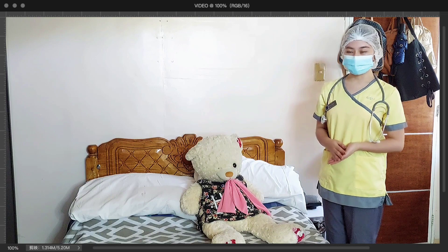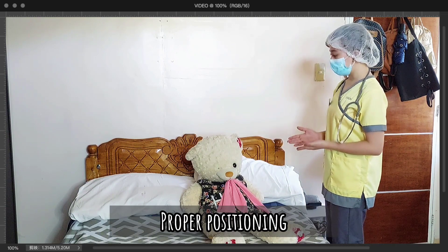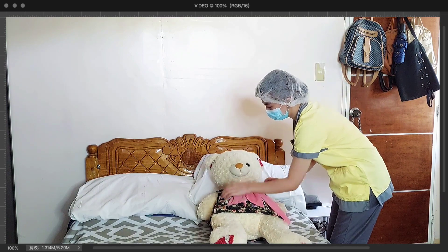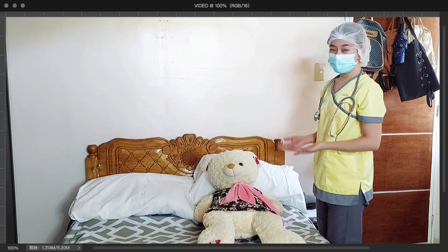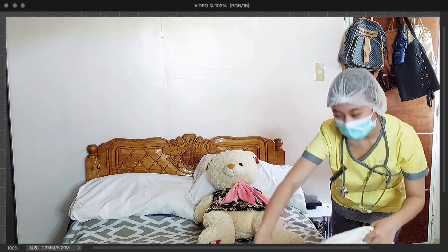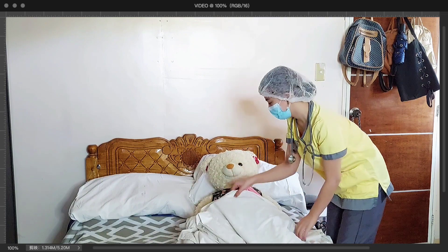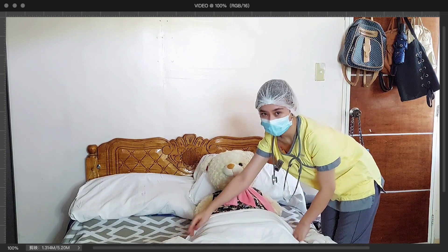After the patient has voided, I will now assist you to lie on your bed with your knees flexed. Assuming that the patient is in the knee-flex position, proper positioning will enhance visualization and effectiveness of the procedure. This will also provide privacy.